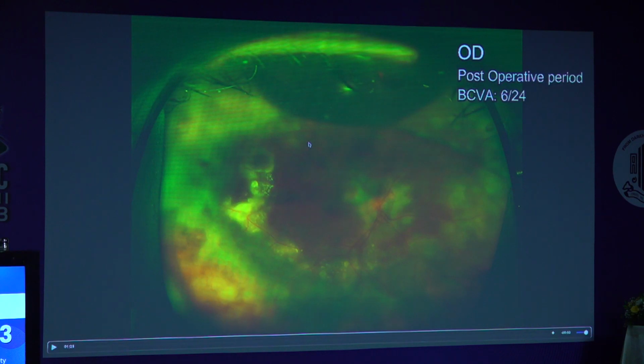What is the indication for full thickness? The full thickness indication will come where this procedure fails, or where there is direct involvement of the retina or the choroid. In this case, we know that lymphoma cells are in the subretinal space, so there is no need to take that. If the biopsy fails in this case, then I will take that.